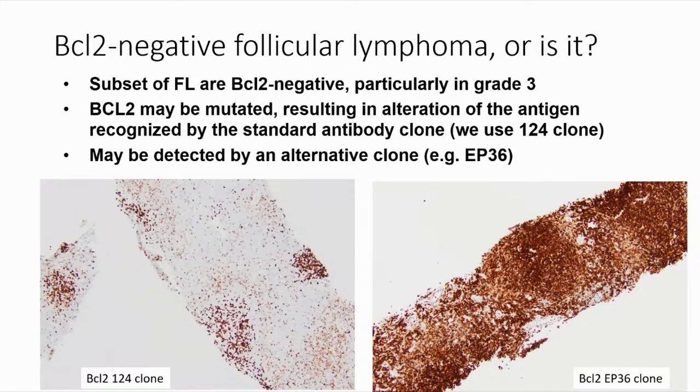But if it's more atypical or you see a more expansive population of CD20, then I'll do a more full workup with our standard panel, looking obviously for cyclin D1, and looking at BCL2 and BCL6. Maybe the patient has a history of CLL, which could be involving, and then you could do LEF1.